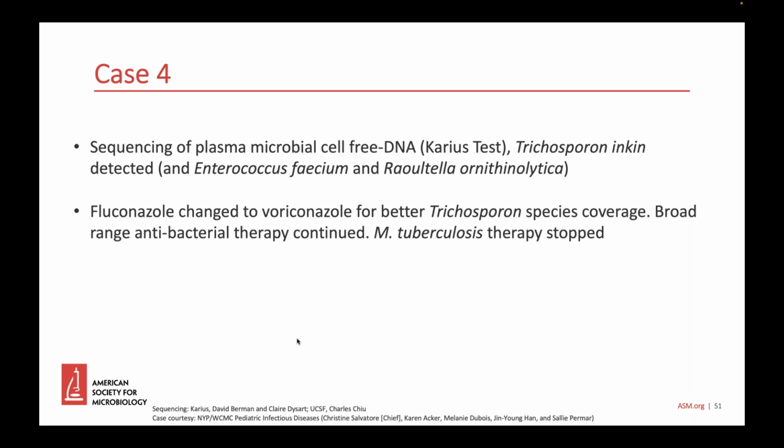There are some rare reports that in the setting of HIV, beta-D-glucan can be detected in the presence of cryptococcal meningitis, but it's really a rare report. So that positive beta-D-glucan with a cryptococcal antigen result was steering us away from Cryptococcus, because Cryptococcus shouldn't cross-react or react with the beta-D-glucan assay.